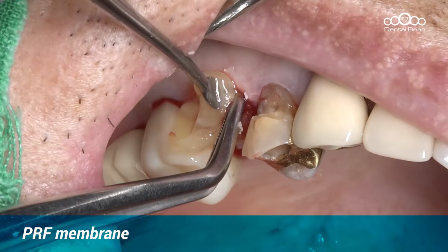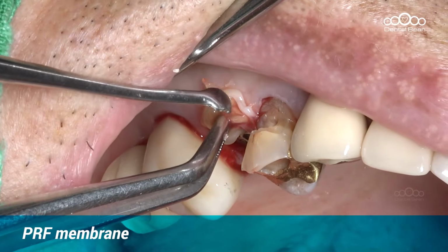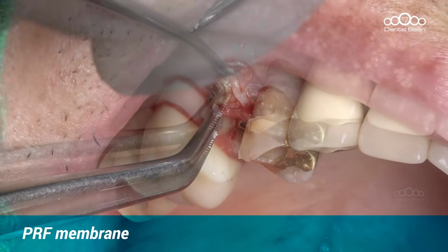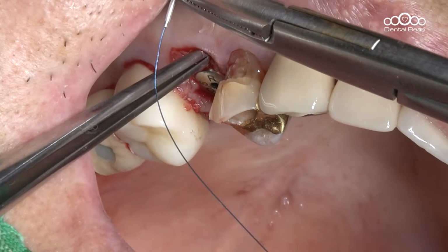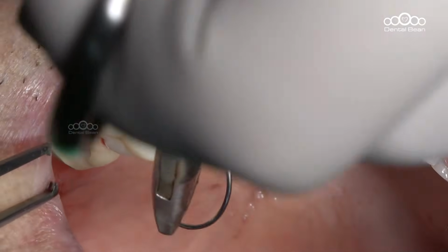A membrane made from the patient's blood is now being packed. But collagen tape or similar domestic collagen products could also be used as an alternative. After about 1 to 2 weeks, it will naturally resorb, while soft tissue gradually grows into the area to cover the site.